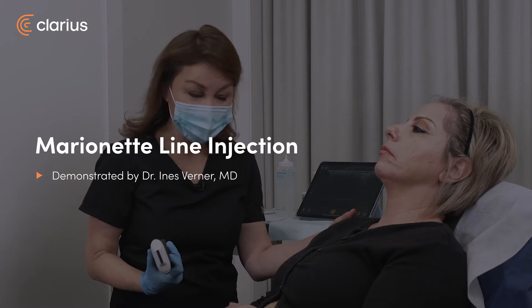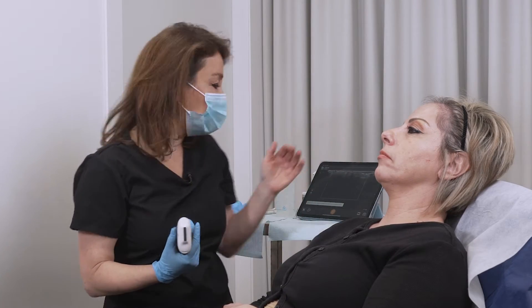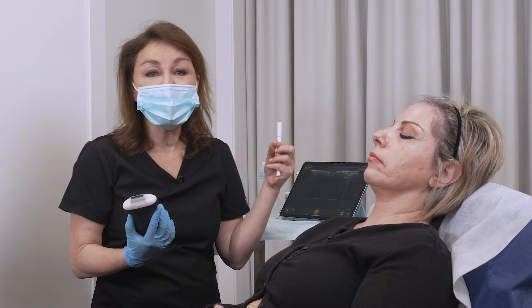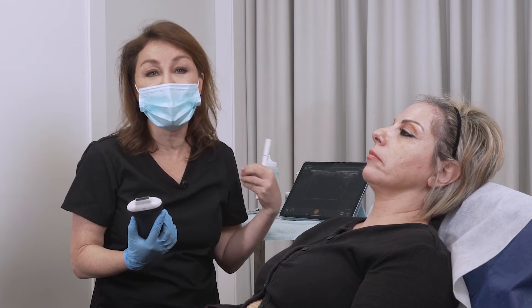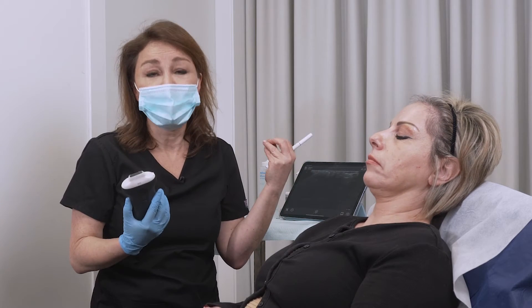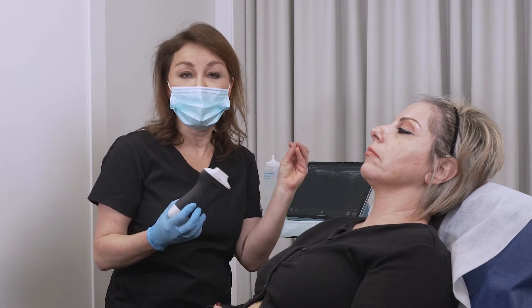We'll start by evaluating this patient, who needs filler treatment in her marionette lines. When treating the marionette lines, it's very important to map the inferior labial artery, because if we hit this artery or inject intravascularly, we can get skin necrosis in that area. This is our main risk and something that can really happen, so we're going to map her inferior labial artery first.